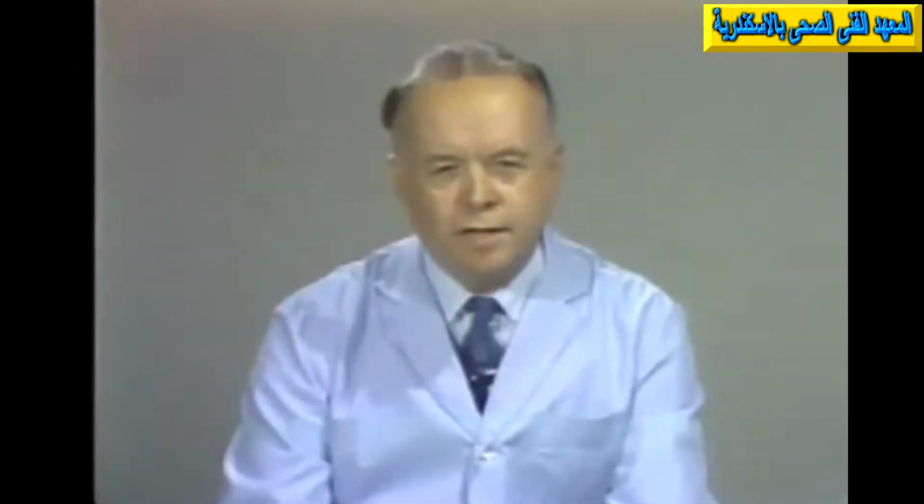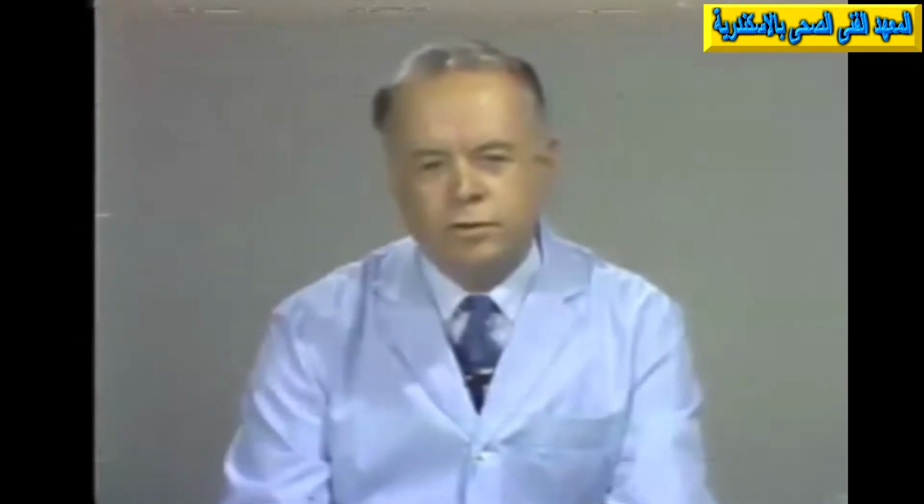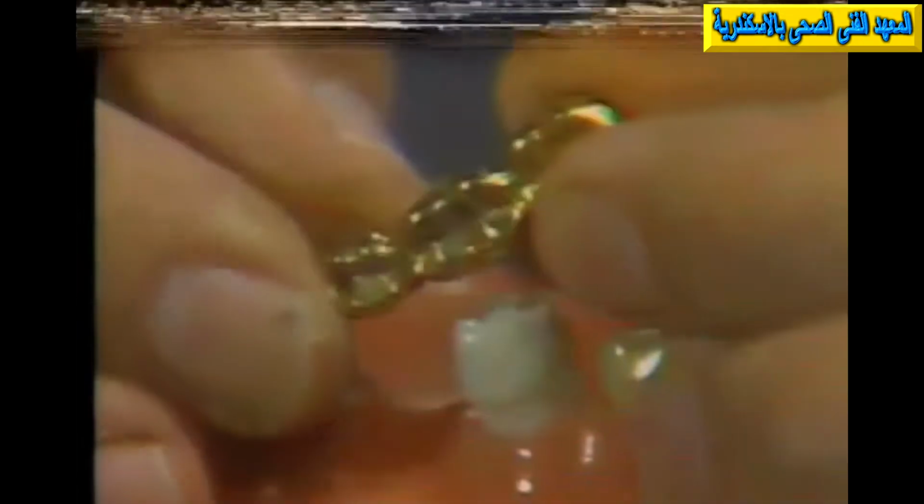As you know, the connector is that part of a bridge which joins the pontic to the retainer, or may join two pontics together. On the model which I have here, we have a 3-unit bridge with fixed connectors, with which you're quite familiar. This gives a solid 3-unit bridge with soldered or cast connectors.